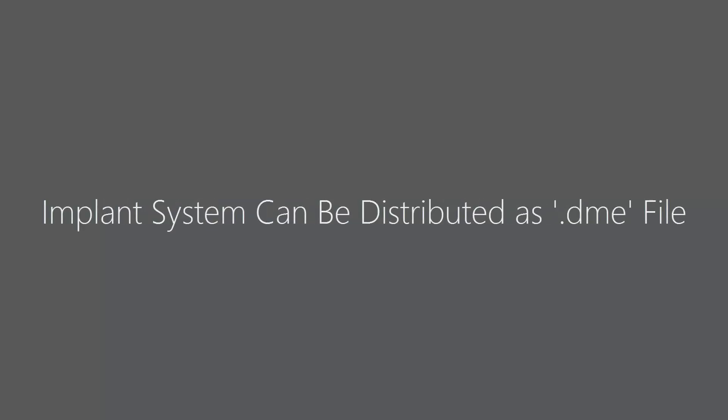Implant systems can also be distributed as DME files. DME files are created by material providers.